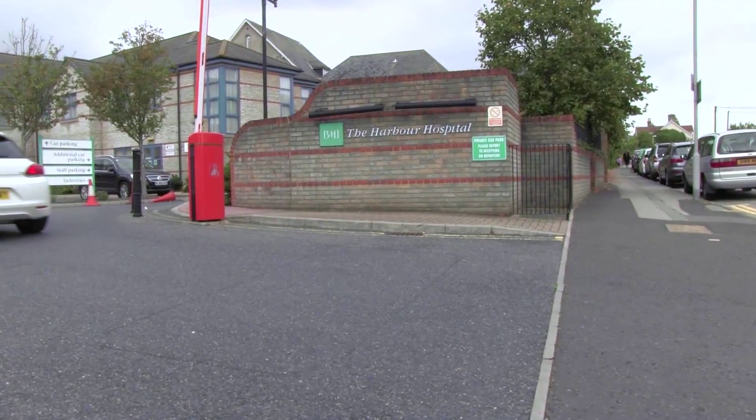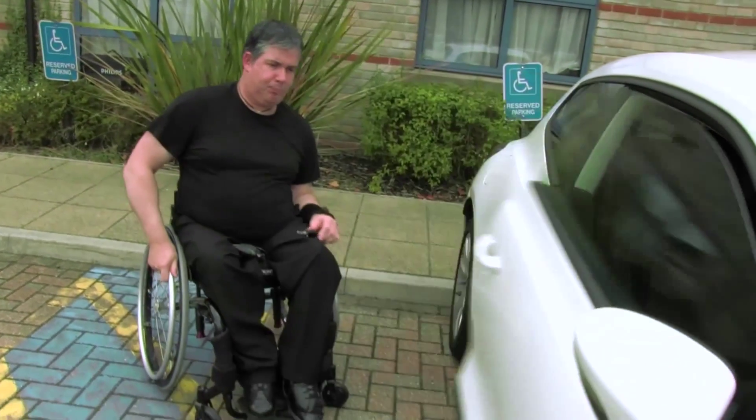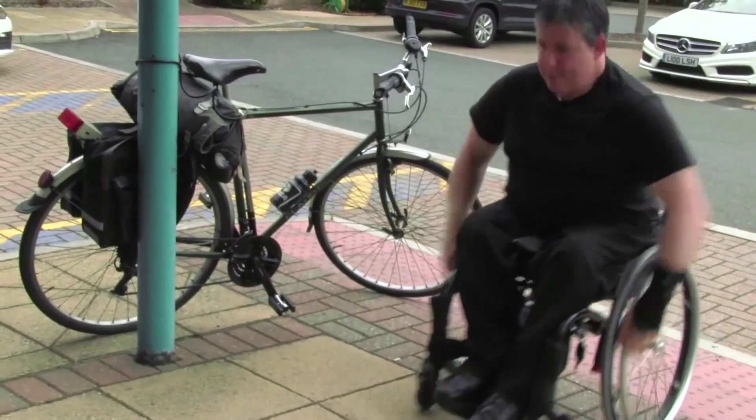I'm David Boucher and I'm a patient here at the BMI clinic. I'm being treated at the moment for pain in my wrist, and part of that is having to use this new Exos Brace.